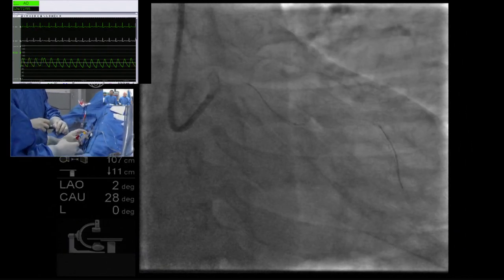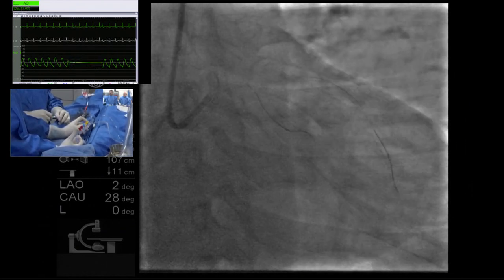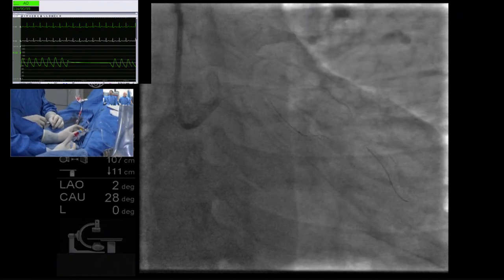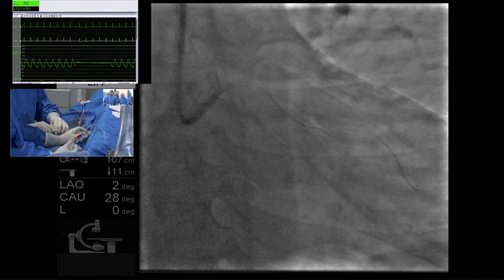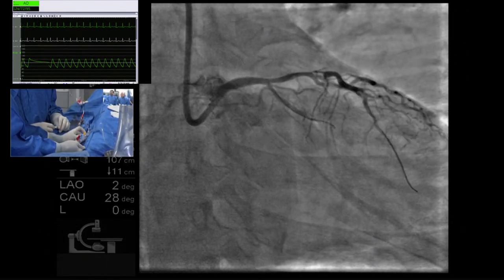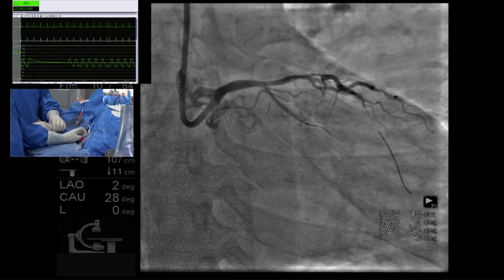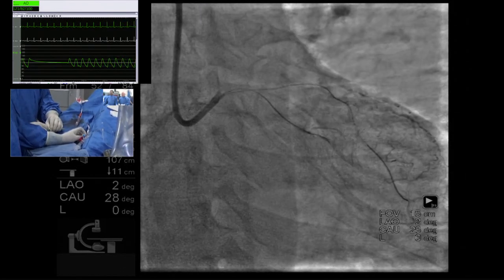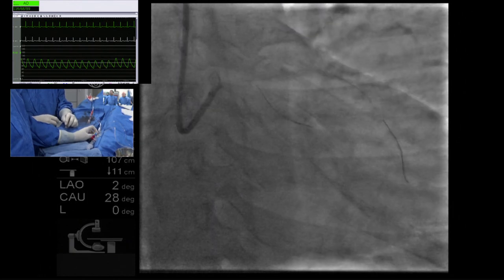And so I think that the challenge with polymer jackets, as many of us will know, is that you lose your tactile feedback, right? What you get from lubricity and the ability to sneak through tight lesions, there's no free lunch, right? For that you give up the tactile feedback, you give up your ability to feel, which is why Professor Saito makes such an important point, that you can very easily get into subintimal planes. Here we see that. Still, even now, I feel very strong resistance. So I'm not sure whether the wire is in the subintimal space or in the true lumen.